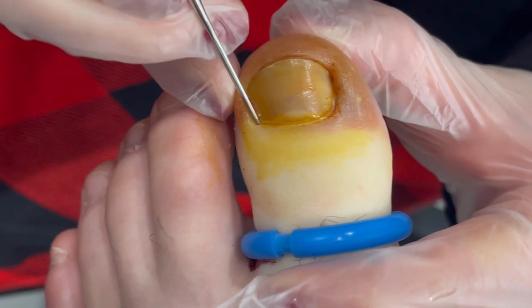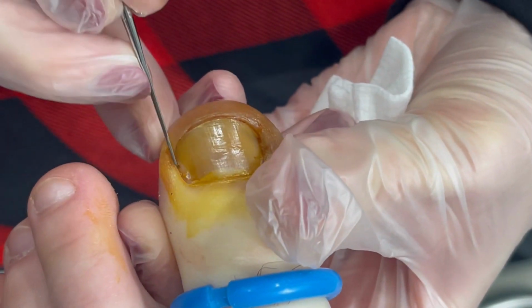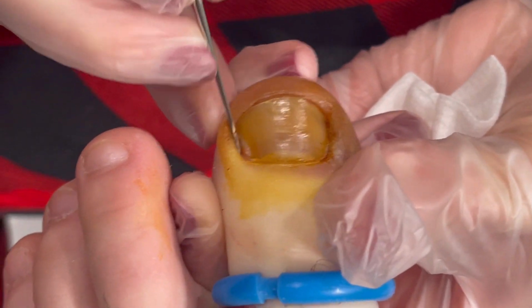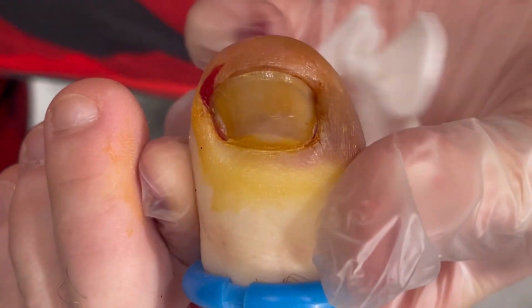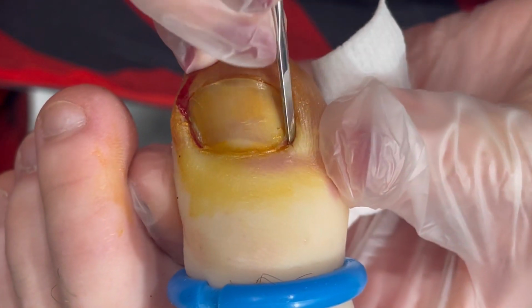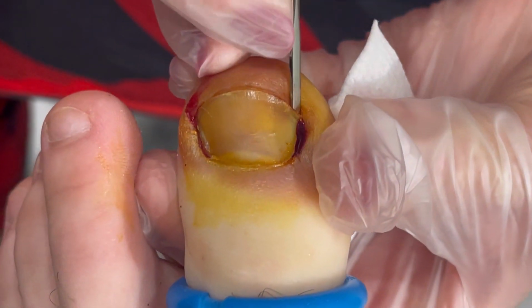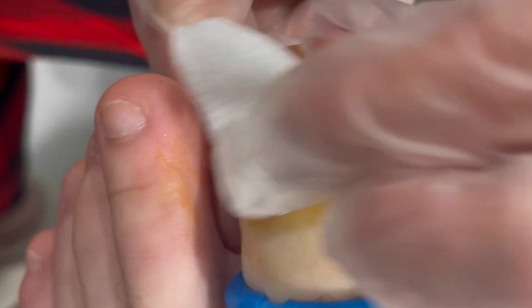Okay, let's see over here. Do you feel any? Relax your foot for me. There we go. Do you feel anything over here? No. I mean, your toe is like rock hard. All right. We're going to loosen this skin on top. We're going to go underneath the nail. Whoop. One big swoop. Yeah, I don't feel anything. Okay, good. I would be hard pressed to think that you could. Whoop, loosen that up. Sound effects.